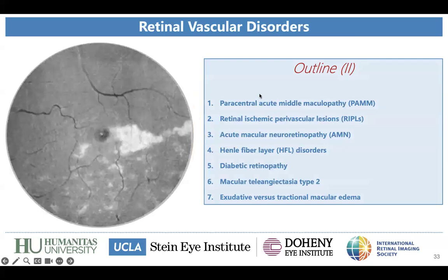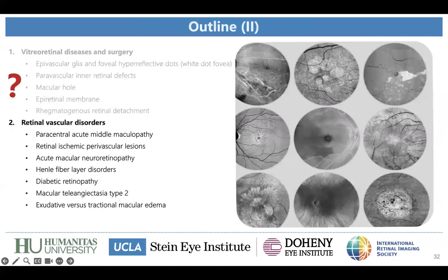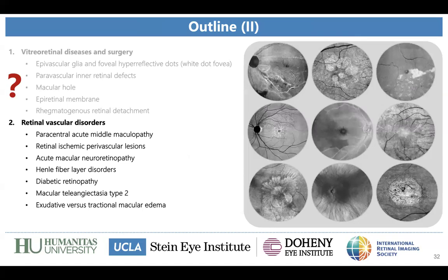Okay. Alessandro, sorry, I was muted. I have two questions. The first one you just answered about the ERM, how to bring en face to the practice. Like you said, you can first grab the ERM where it's easier through the en face. I have another question.